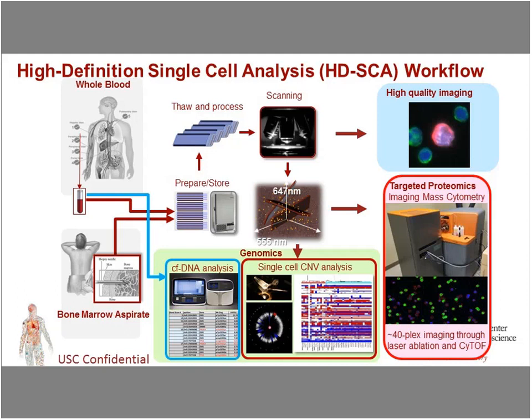Plasma is first separated and frozen at -80 degrees for future use. Then red blood cells are lysed. Then the nucleated cells are plated as a monolayer on custom-made cell adhesion glass slides, followed by storage in a biorepository. 10 to 12 slides will be prepared for every tube of 10 ml blood.